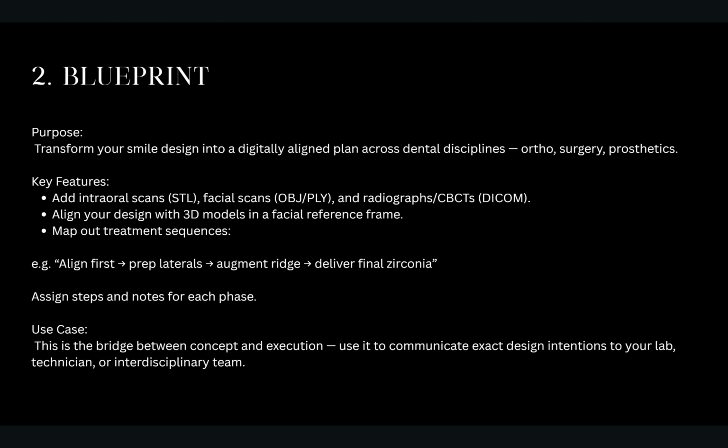Step number 2 is blueprint. So this is where you can translate the work that you've done from the 2D smile design phase across to the 3D phase. The purpose of this is to transform your smile design into a digitally aligned plan across dental disciplines, whether that be orthodontics, surgery, prosthetics, a whole host of things.